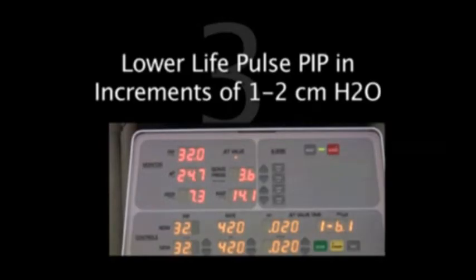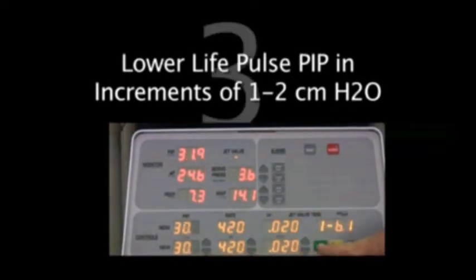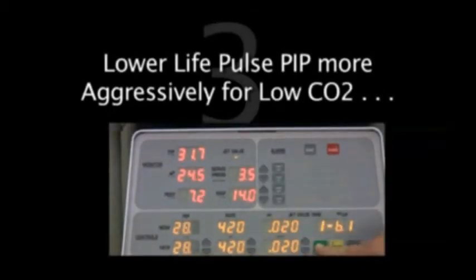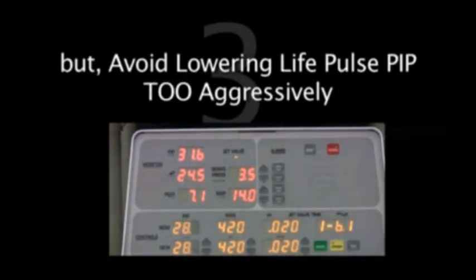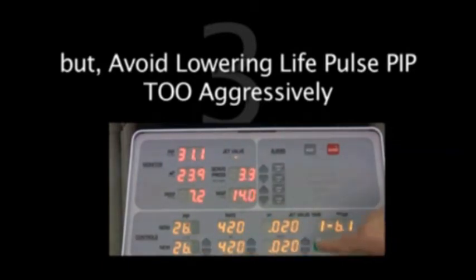Third, lower the LifePulse PIP. As weaning begins in earnest, reduce the PIP in increments of only 1 to 2 centimeters of water, unless the CO2 is below 40, in which case you must lower the PIP more aggressively, perhaps in increments of up to 5 centimeters of water. But be careful about weaning too quickly on the peak inspiratory pressure. Small changes in PIP and tidal volume can have very dramatic effects on CO2 and oxygenation during high-frequency ventilation, whether you're increasing or decreasing support.